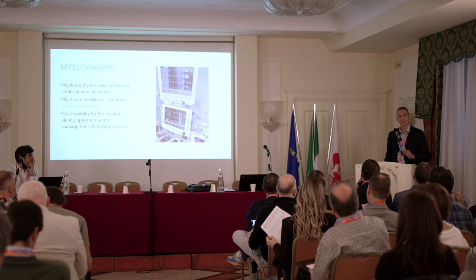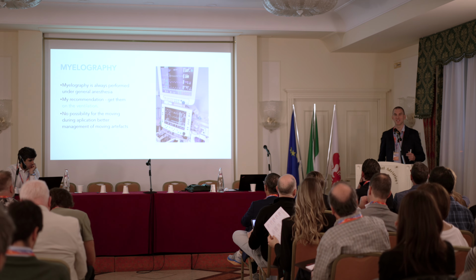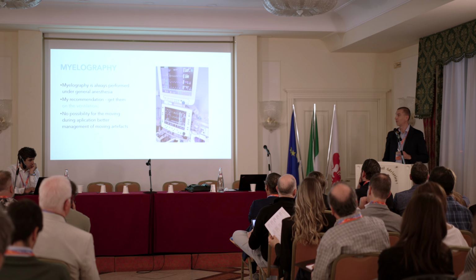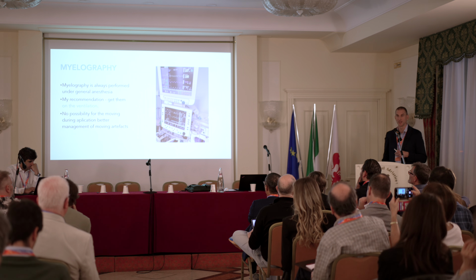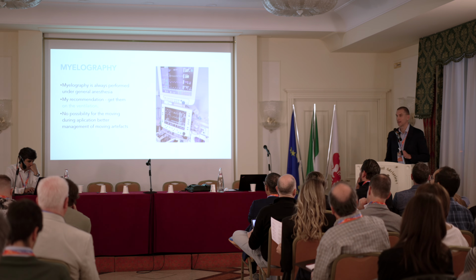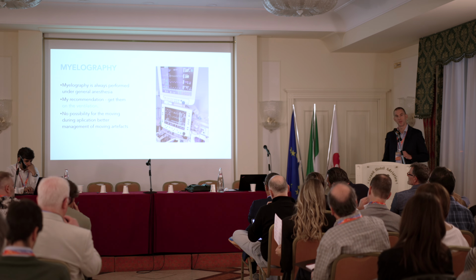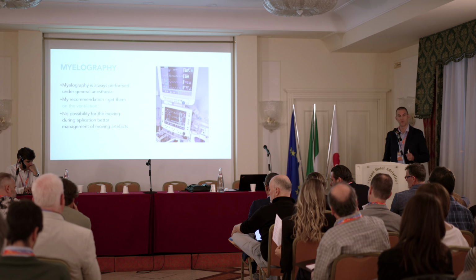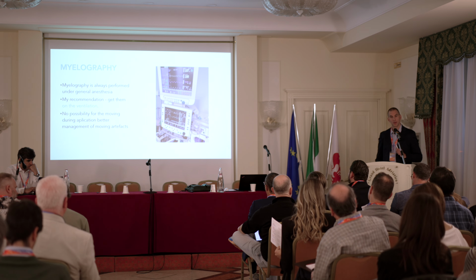I think there's some lecture about apnea or not. So there's a team on how to perform apnea, so everything is up to you and your machine. It's not a big deal to do it, and the quality of images is much better with apnea. There are no moving artifacts, and you are much more comfortable with the result.